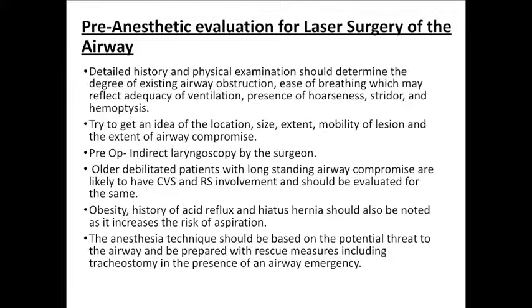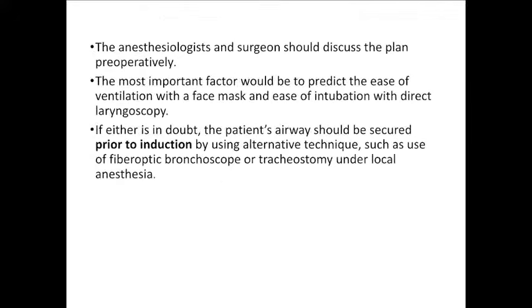Pre-anesthetic evaluation of laser surgery in the airway. The first thing is a detailed history and physical examination, which should determine the degree of existing airway obstruction along with the ease of breathing, and any conditions like the presence of hoarseness, stridor and hemoptysis. There should be a clear idea about the location, size, and extent of the lesion. In older and debilitated patients, be very thorough.